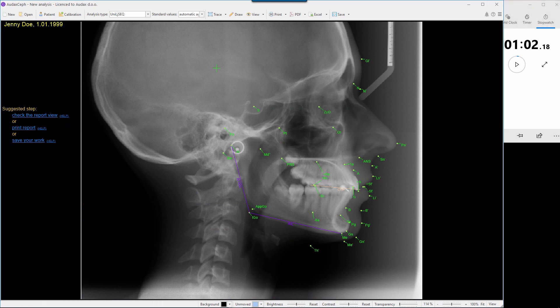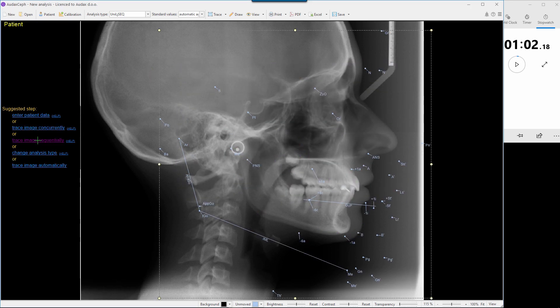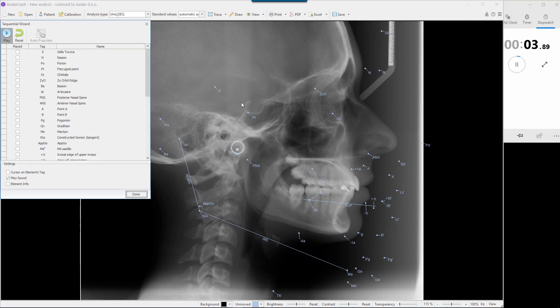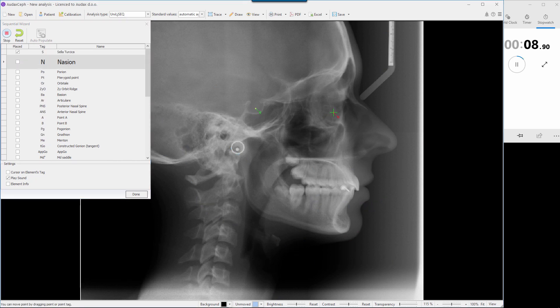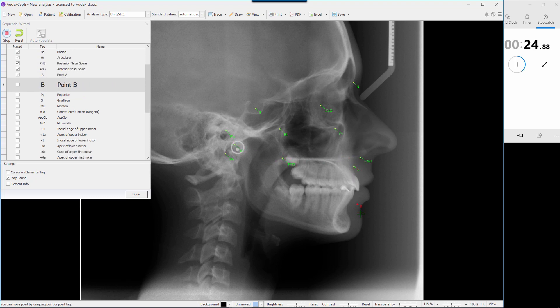The second way would be tracing points sequentially — one after another. I will open the same image again and trace it sequentially. I will reset this and start. Trace image sequentially: sella turcica, nasion, porion, PT point, orbitale, zygomatic orbit ridge, basion, articulare, PNS, ANS, A point, B point, pogonion, gnathion, menton, constructed gonion.